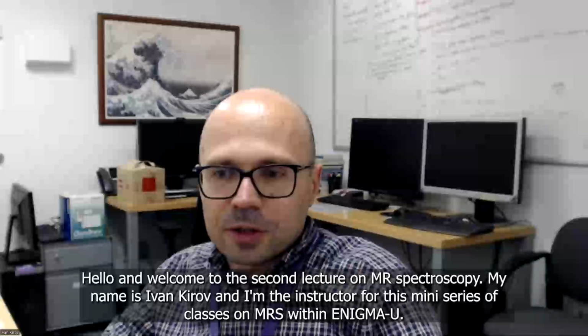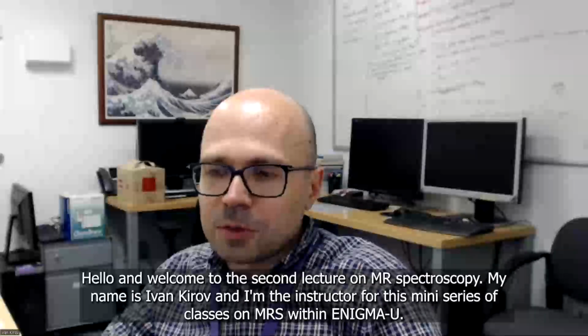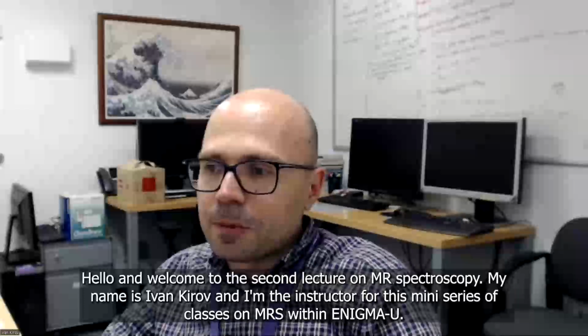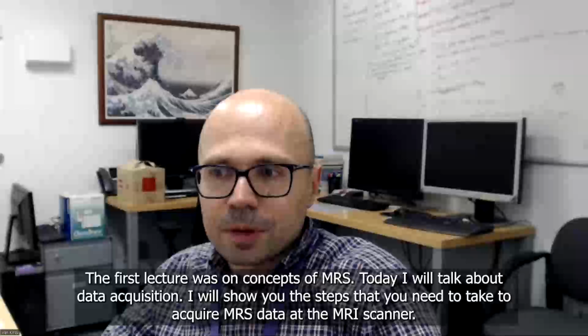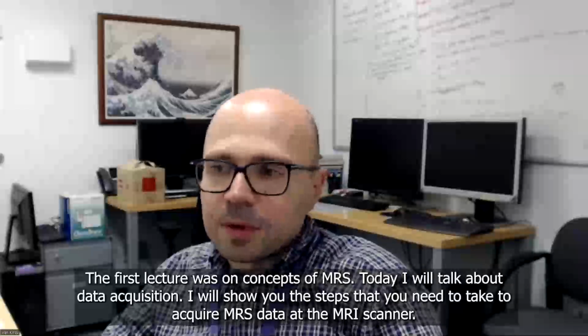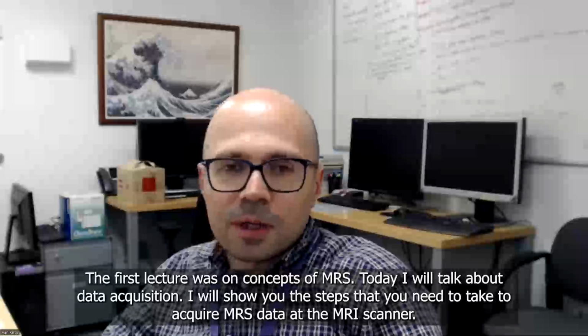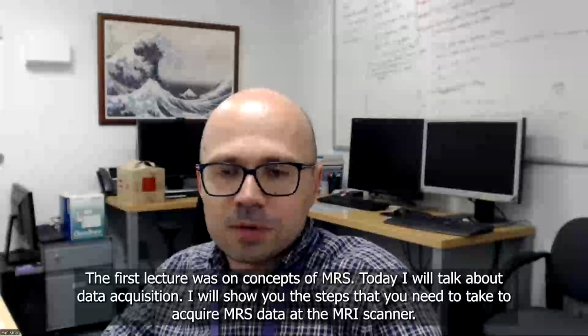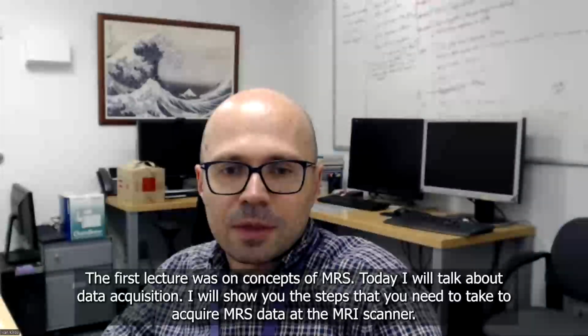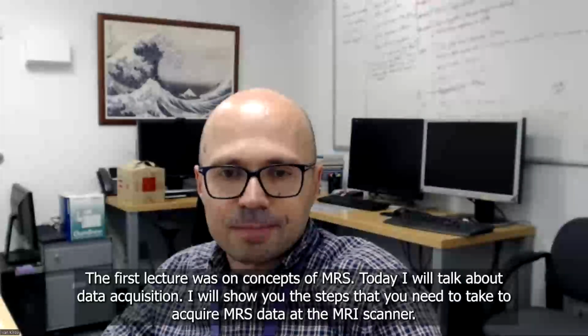My name is Ivan Kirov and I'm the instructor for this mini series of classes on MRS within Enigma-U. The first lecture was on concepts of MRS. Today I will talk about data acquisition. I will show you the steps that you need to take to acquire MRS data at the MRI scanner.